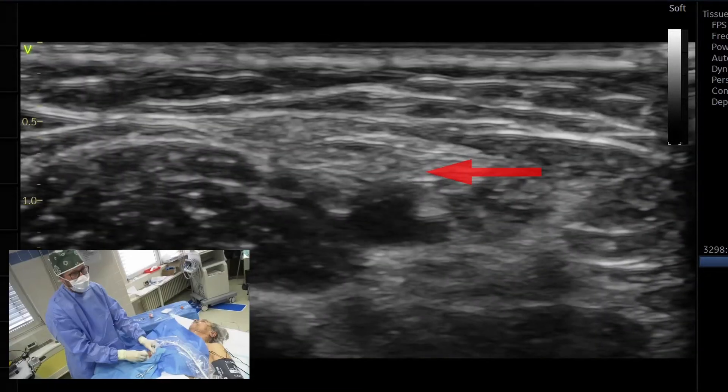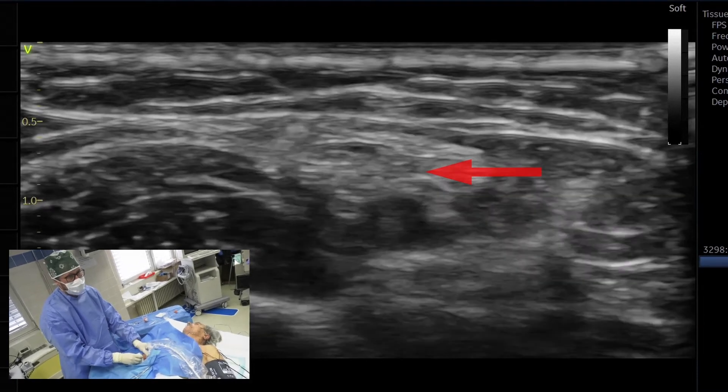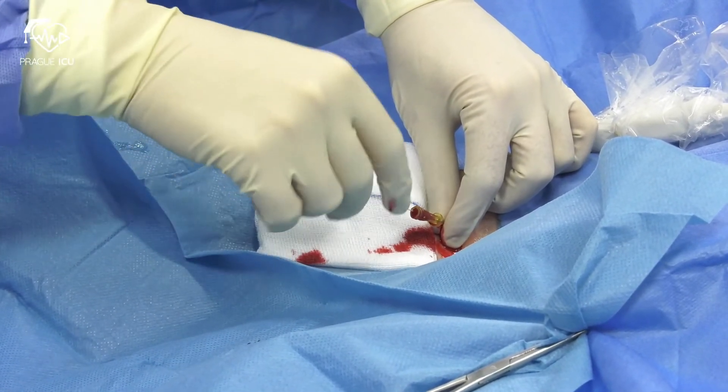Now you can see the tapping on the arterial wall. When a flush of red pulsatile arterial blood is obtained, advance the wire into the needle.